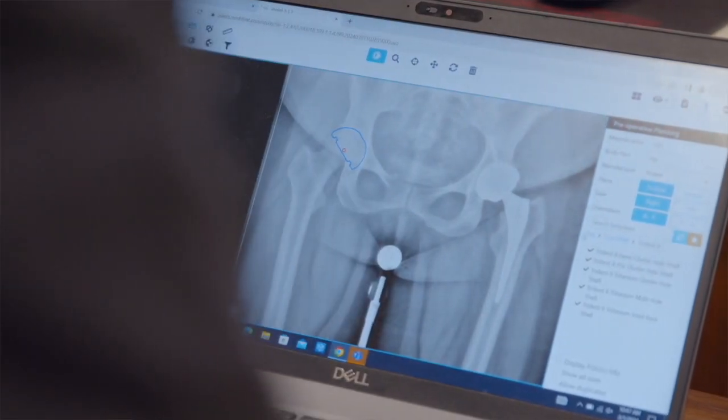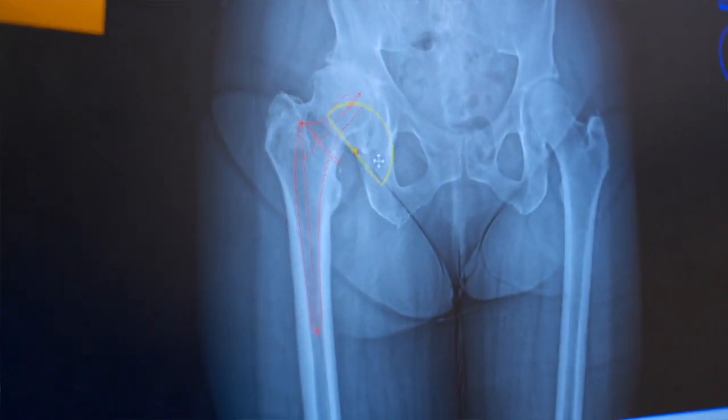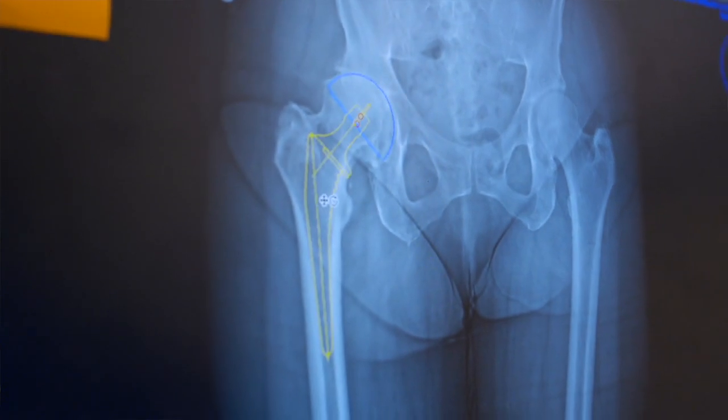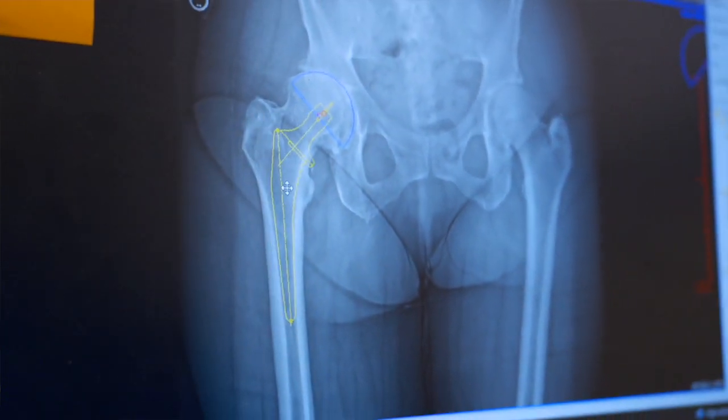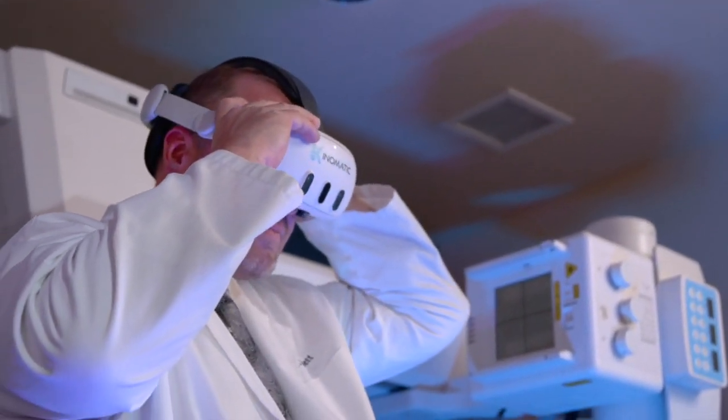Traditionally, these surgeries are planned out using your original diagnostic x-rays. Those are the x-rays that you've recently taken to help us figure out that you may need a joint replacement surgery in the first place. Implant templates are then placed on top of these x-rays to help us estimate what size implant and position is the best fit for you. These are basic tools that have been around for many years with good results, and they are usually covered by your insurance.